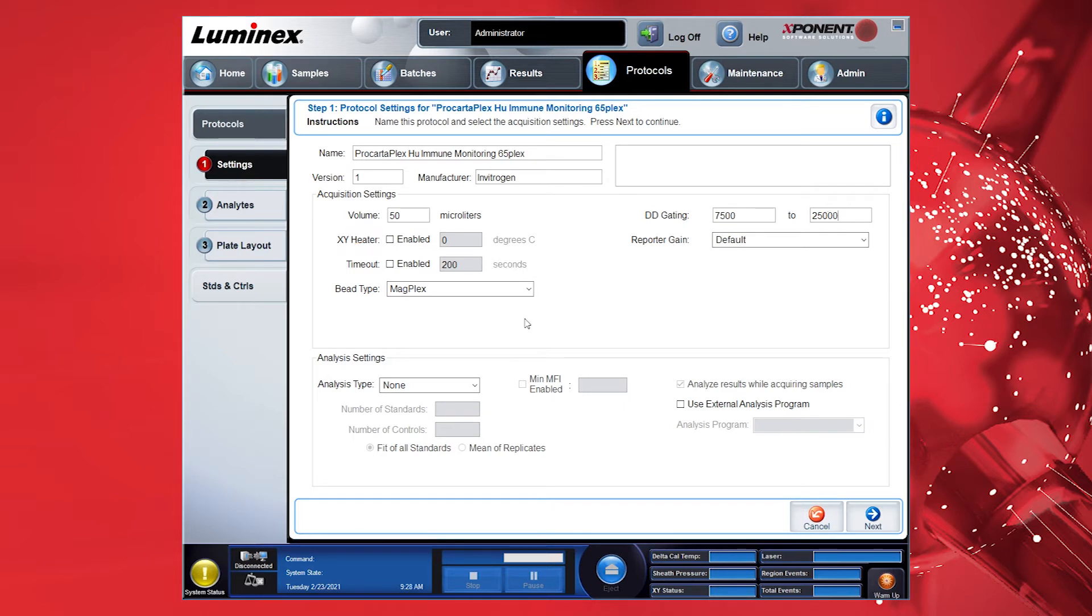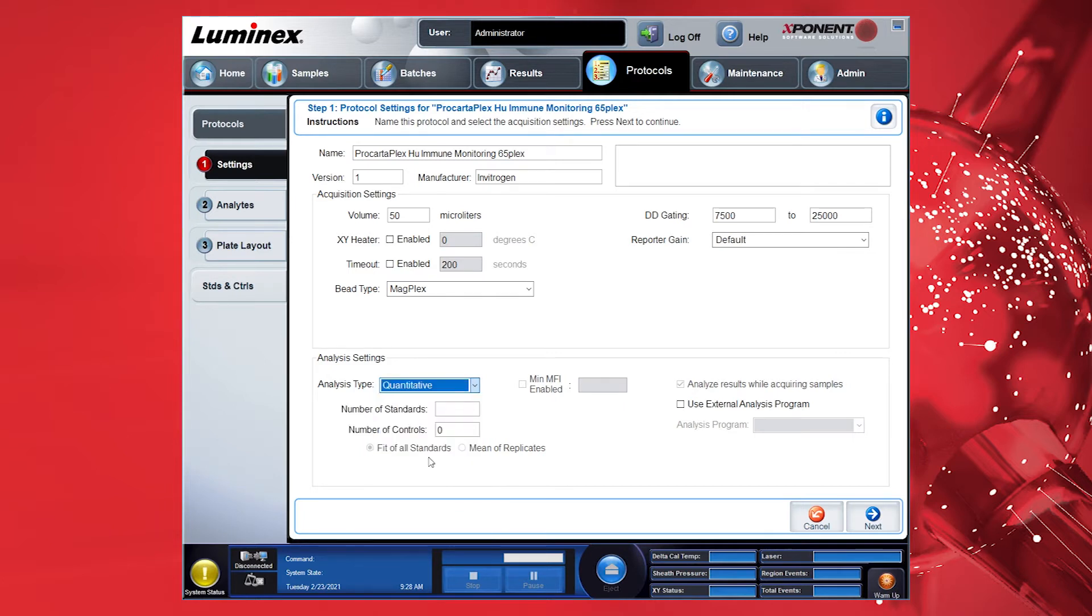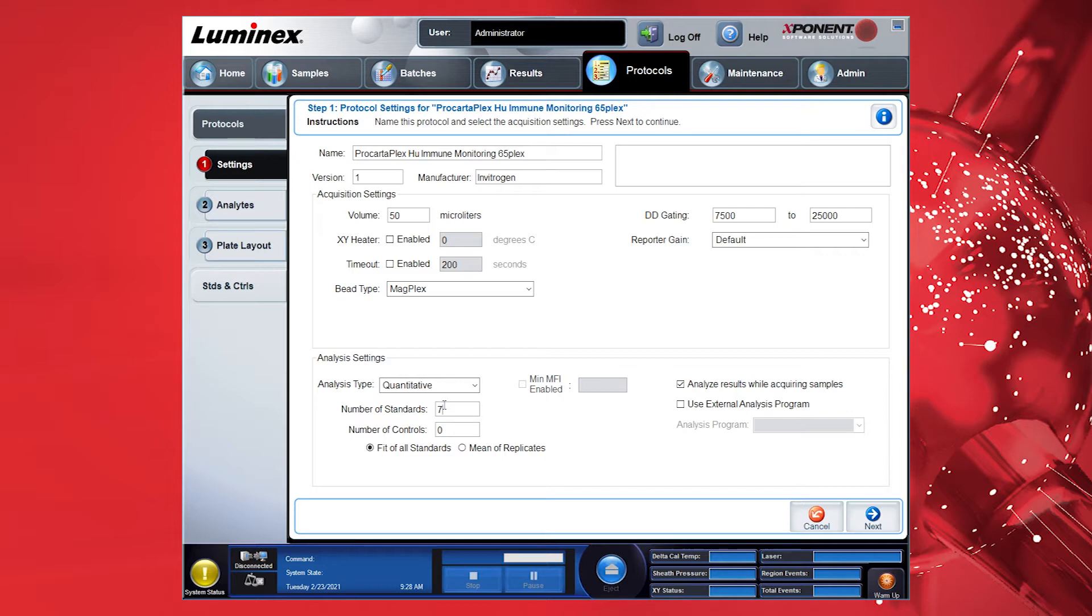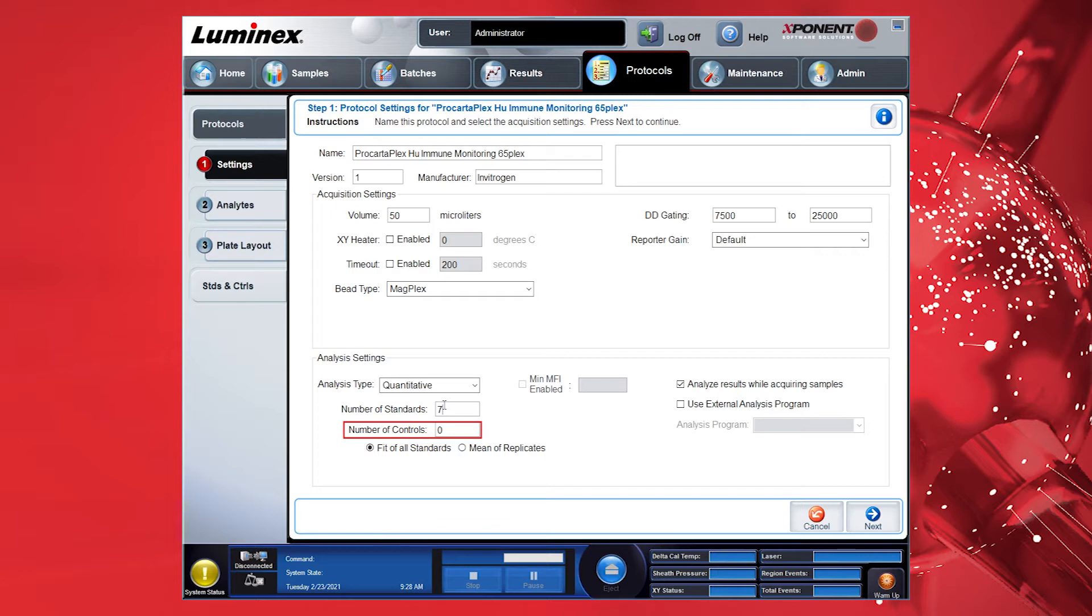Next, enter the Analysis Type. As there is a standard curve in the ProCartoPlex Immunoassay, it is recommended to use the Quantitative setting. This allows you to enter the number of standards. For a ProCartoPlex assay, the number of standards is 7. For some assays, controls may be used and you can select those in the Controls section or leave blank if none are used.